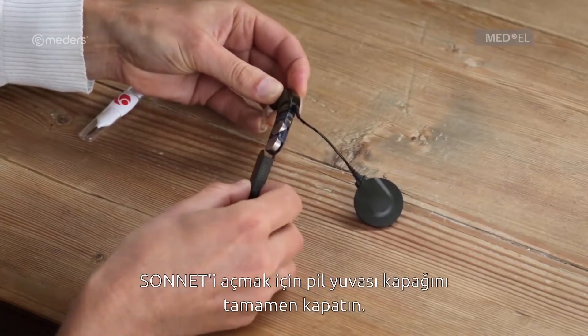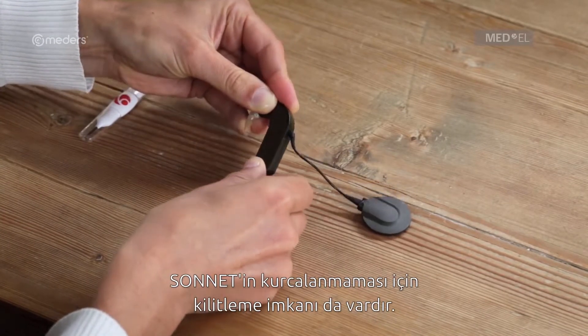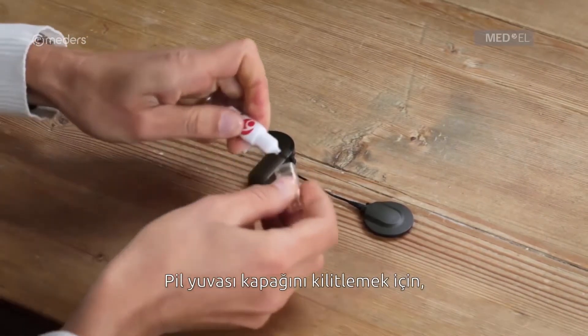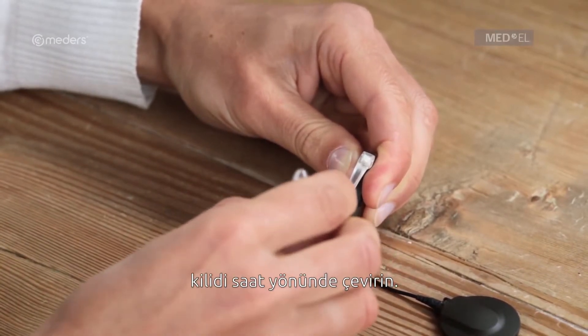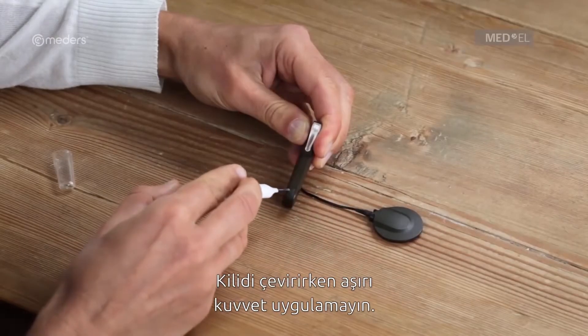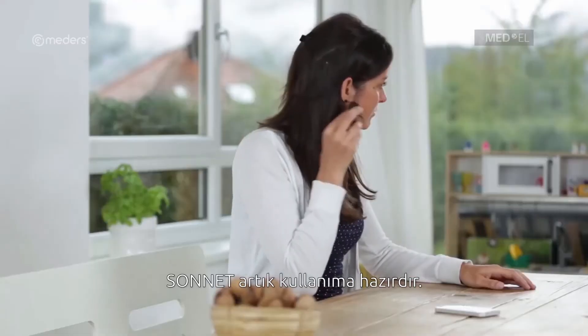To turn on Sonnet, fully close the battery pack cover. The battery pack can optionally be locked to make Sonnet tamper-proof. To lock the battery pack, use the screwdriver provided with your Sonnet kit to turn the lock clockwise until the notch is facing sideways to the battery pack. Be careful not to use too much force when you turn the lock. Sonnet is now ready to use.